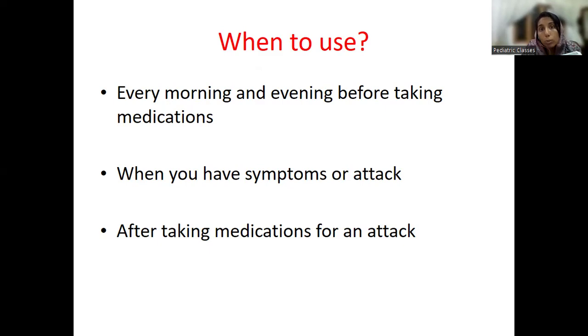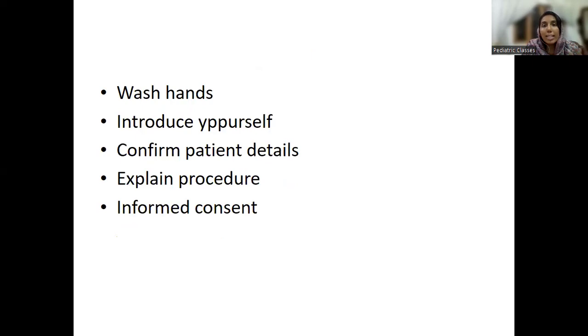We can also use this when you have had an attack and have taken the reliever medication. After that, you can use it to check whether the PEFR of the patient has improved. If it has improved, that shows the patient is responding to the medications, and you can decide upon your treatment. So what exactly is the procedure?